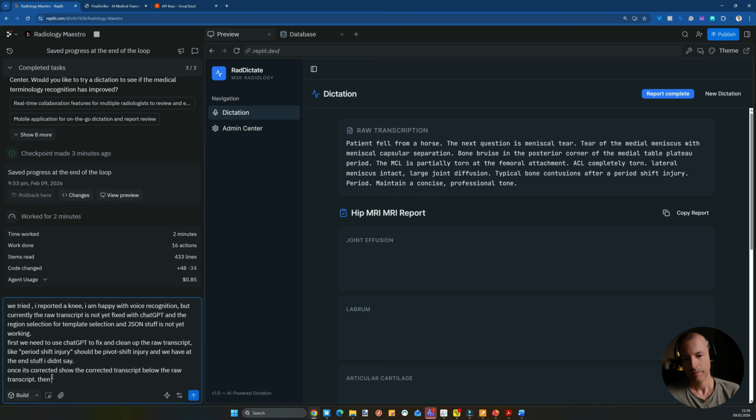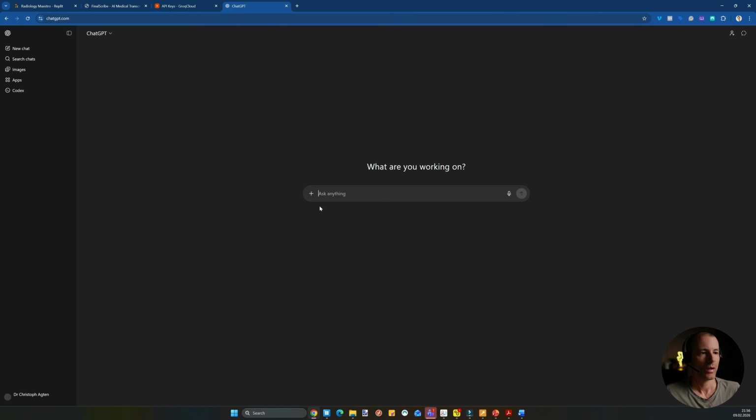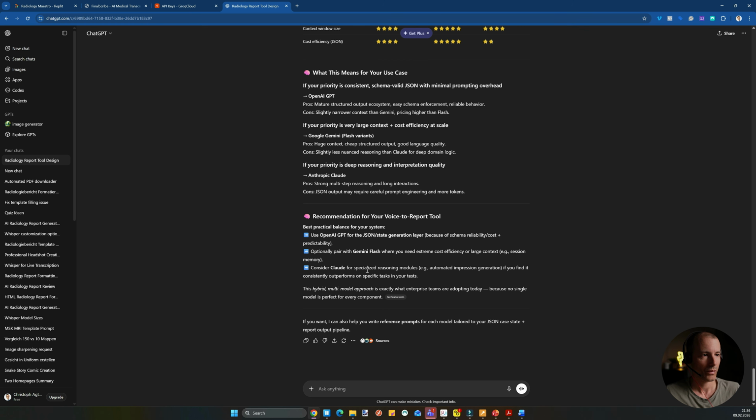So we can also do now, we go to ChatGPT and we ask it, I ask it a little bit here already. I need you to create a master prompt for fixing the raw transcript from Whisper using Groq into proper medical and radiology terminology, fixing words that are obviously not correct in the context, but make sure not to invent stuff. And if you identify punctuation or formatting comments.